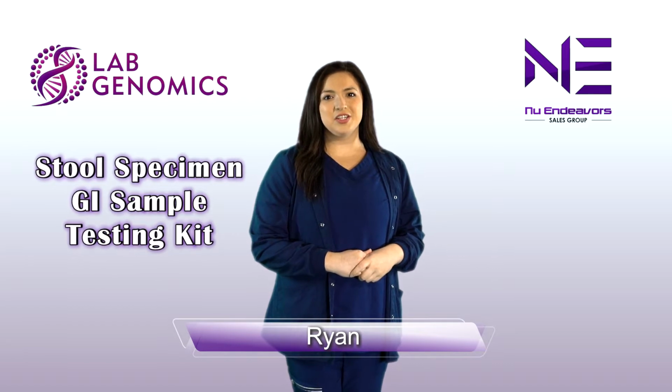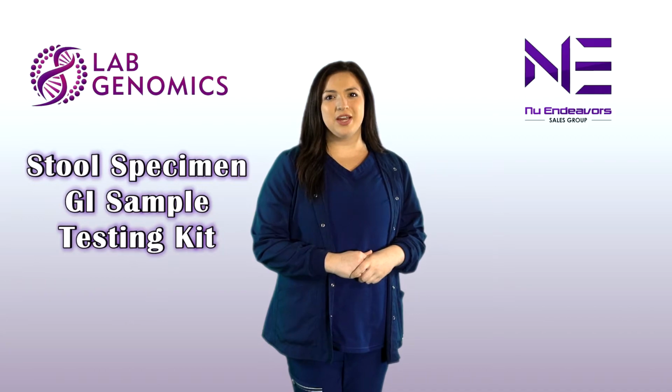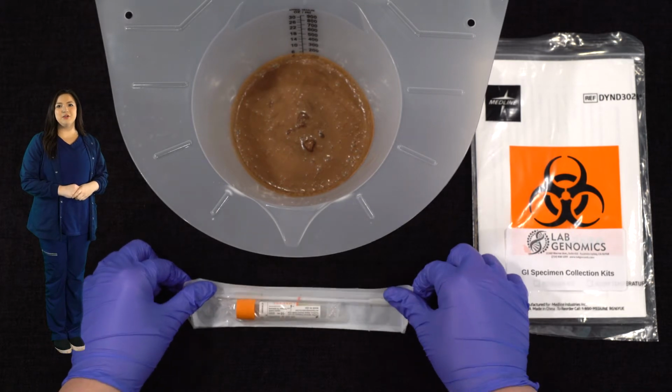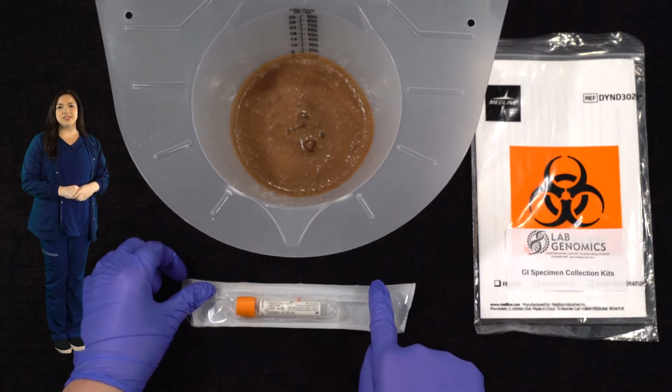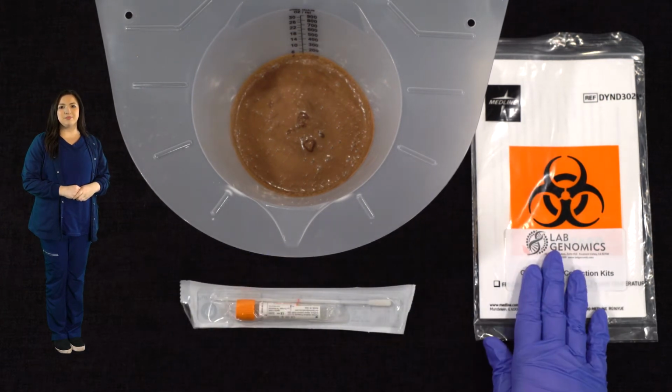Today, I will be instructing you on how to obtain a proper stool specimen using our gastrointestinal panel sample kit. First, gather supplies. For the specimen, you will need the swab kit, complete with the sterile flocked collection device and transport system tube, personal protective equipment, and Lab Genomics form.